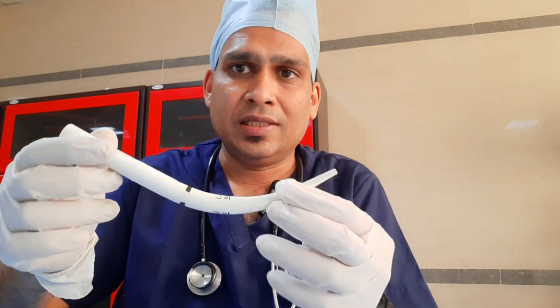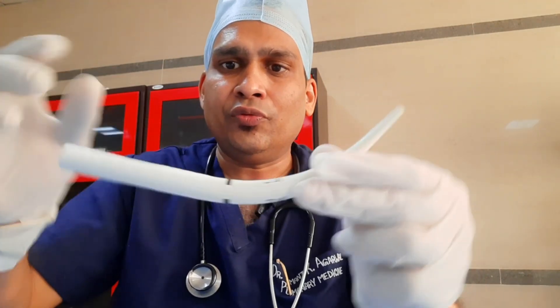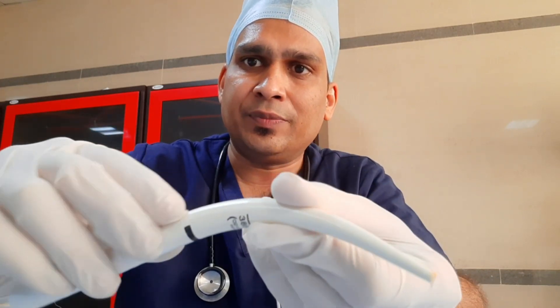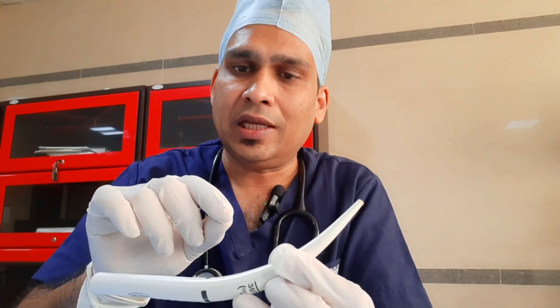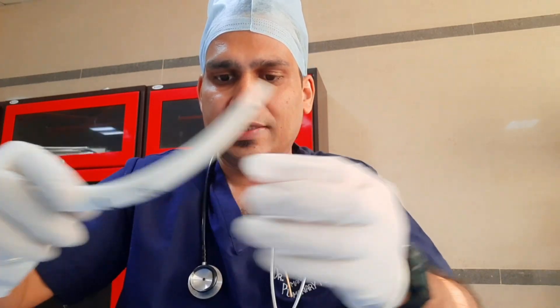This is the self-lubricated dilator. You can see this black mark — we have to insert this dilator up to this mark, going from upward to downward. The size is 12.7 mm, so we have to take an incision of at least 12.7 mm at the site of the intertracheal space.